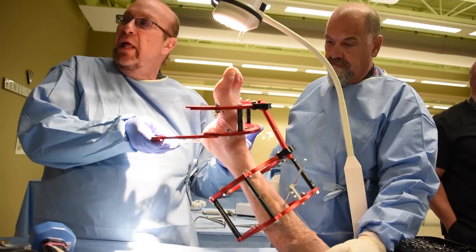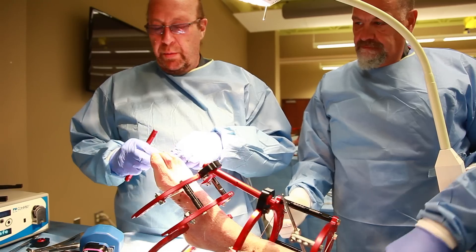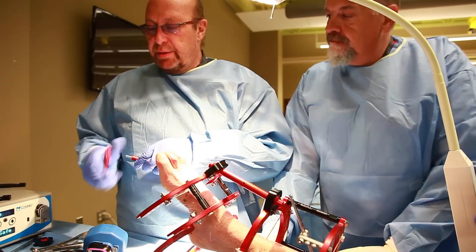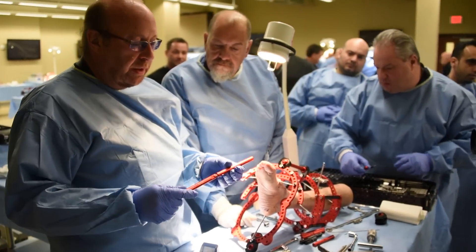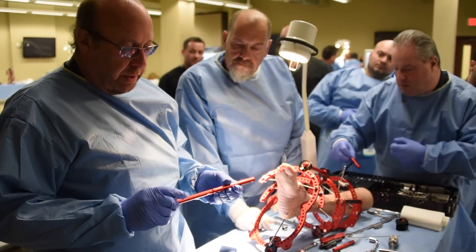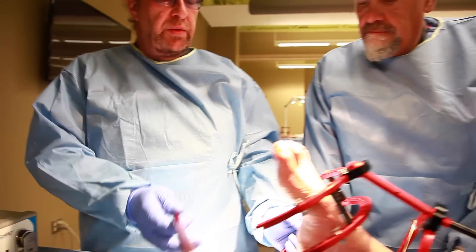The nice thing about these struts is we can make them pretty much any length we want. Taking two 100s obviously makes a 200; taking two 150s obviously makes a 300. We can make them whatever size we need.